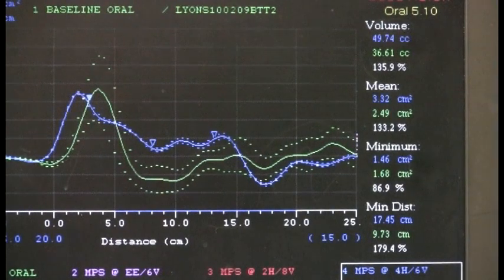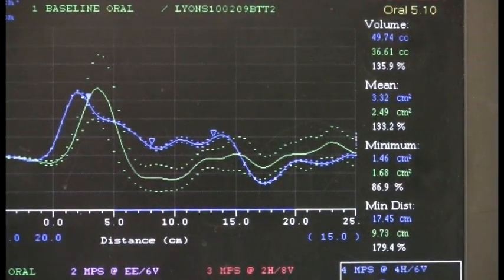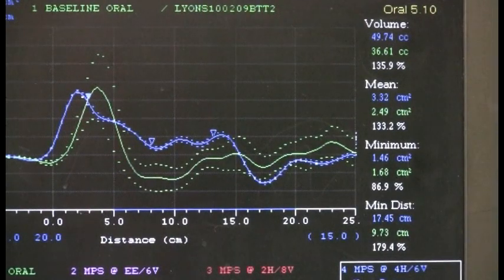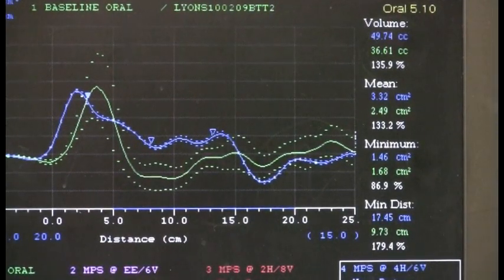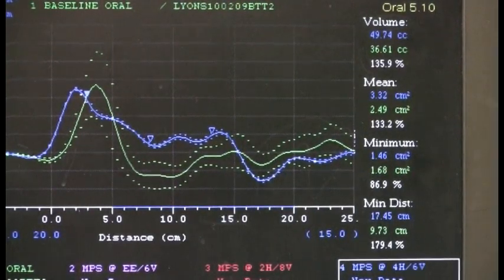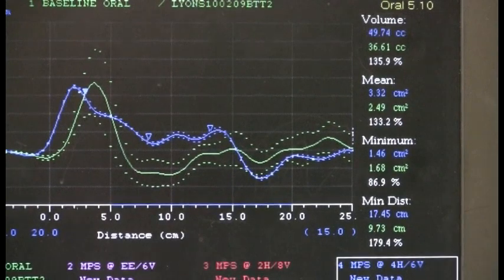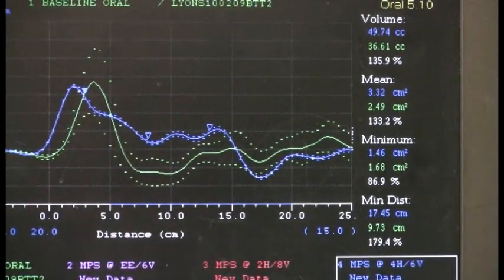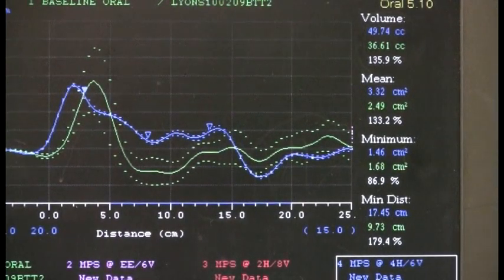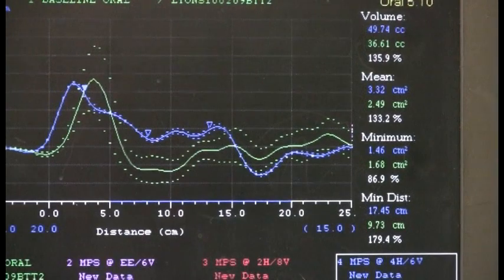So the next step in this process would be to select the starting position, which would be the bite registration. And I think in Teresa's case, because we're basically at end to end or 2 millimeters anterior, it would be very comfortable for her to start with an end to end 6 millimeter simulator that we would attach the handles and the bite forks on and proceed to get our starting position for the titration process.